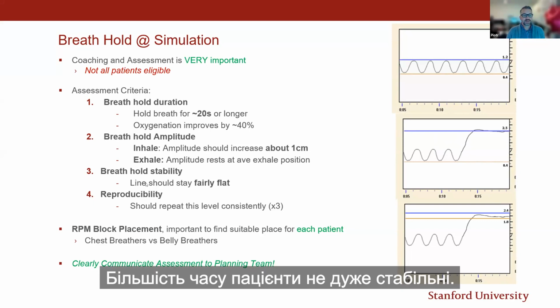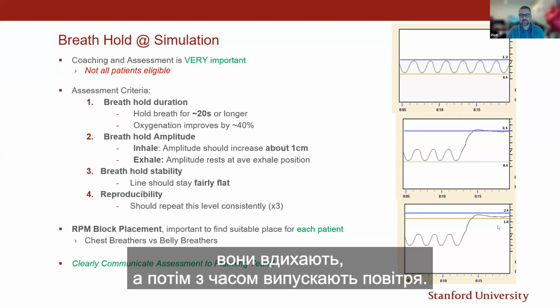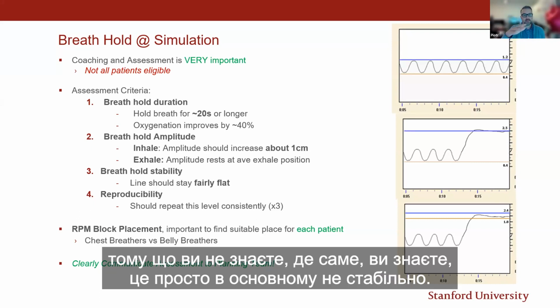A lot of the time patients are not very stable. So they'll breathe in, you can see a little bit of an example here. They'll breathe in and then they kind of seep out over time. And again, you just can't gate off that because they're just basically not stable.